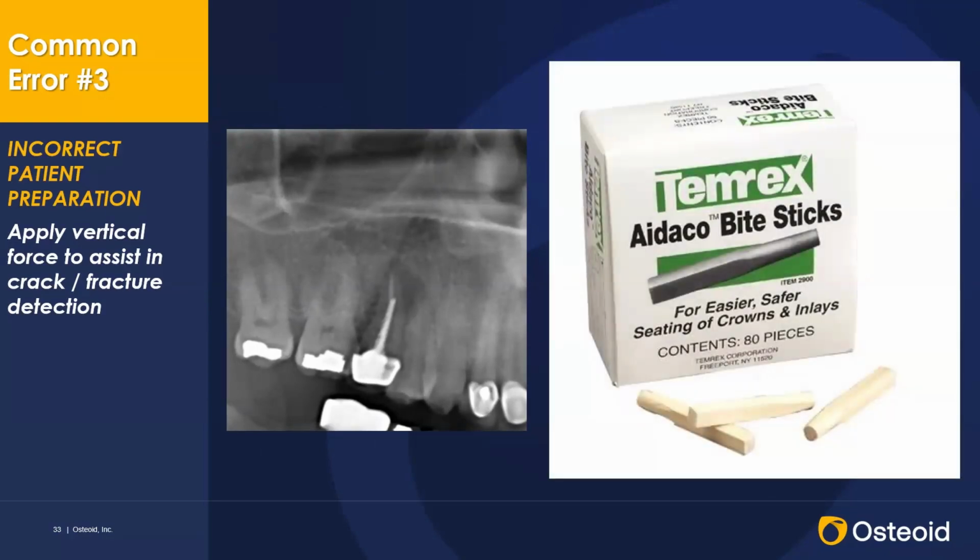And so what we will often do is actually take 2 cone beam CT scans. We'll take one initially when we're looking at fracture detection or crack detection, and if we don't see the fracture, we'll use either bite sticks, or you can use a cotton roll, or any other device like a tongue depressor, and have the patient bite on that during the scan. This is difficult with cone beam CT units that use an anterior bite block, because they innately separate the teeth.